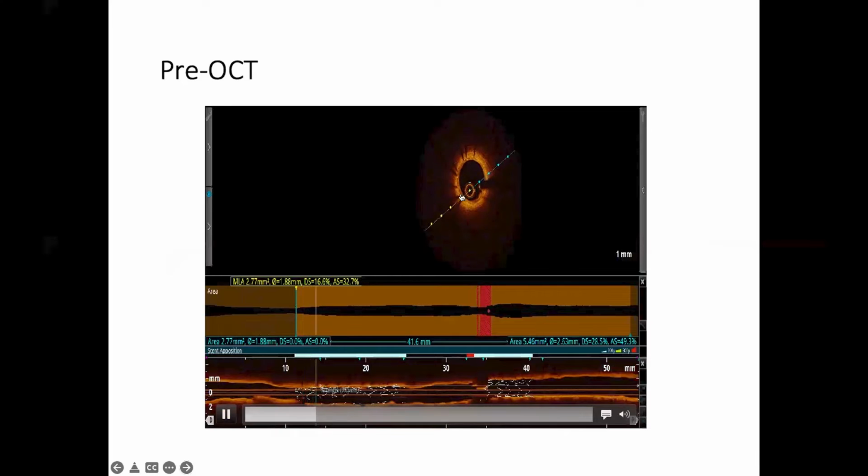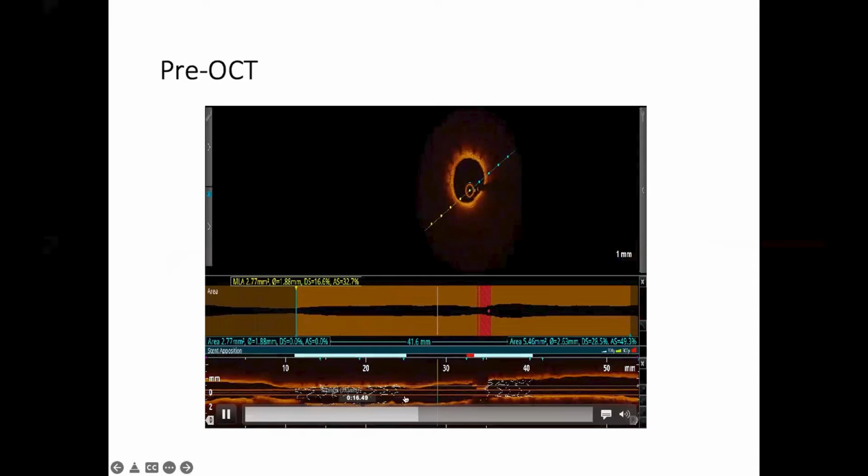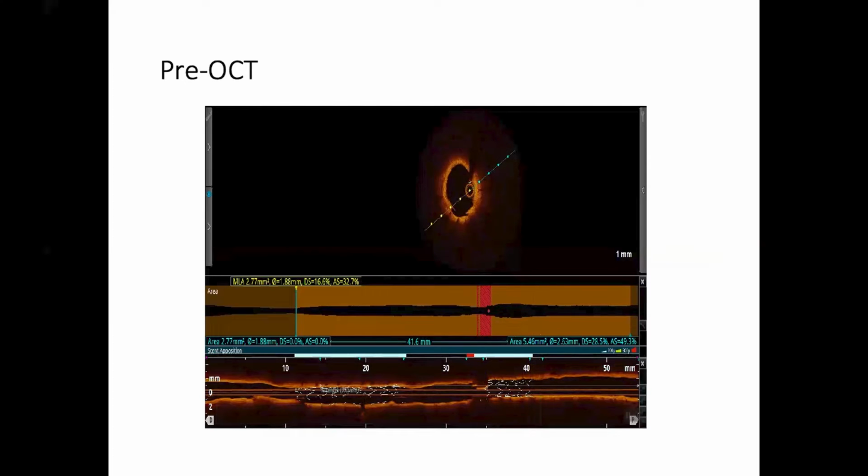Did you dilate the stent with the balloon which comes with the stent? No, I do dilate with the one which comes with it, but frequently I use a scoring balloon if there is fibrosis, and in this particular case, because it's 1 year and 3 months, I could see the intimal hyperplasia, some fibrosis. So just to prepare the bed well, I used a 3 mm scoring balloon and went up to 24, 26 to 28 atmospheres. So for post-dilatation, do you use the balloon which comes with the stent? Yeah, post-dilatation with the one that comes with the stent.